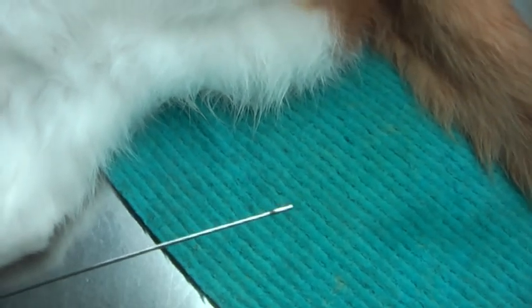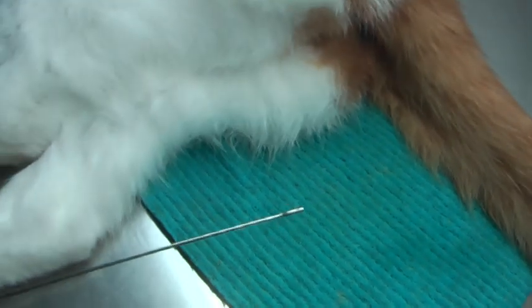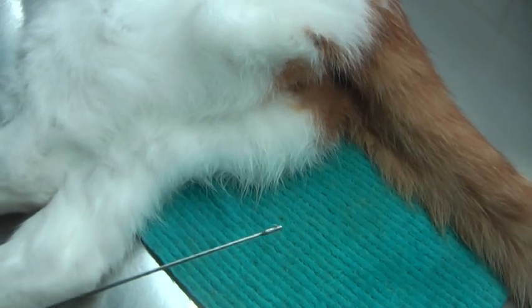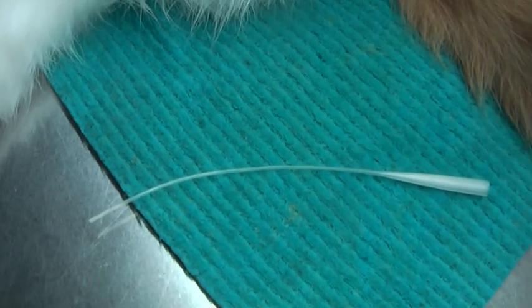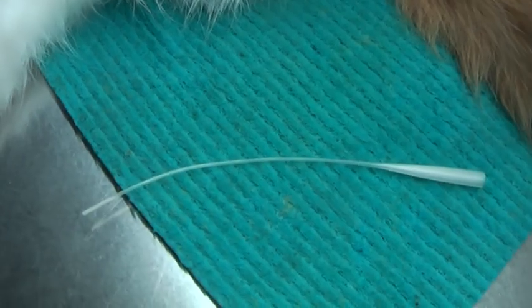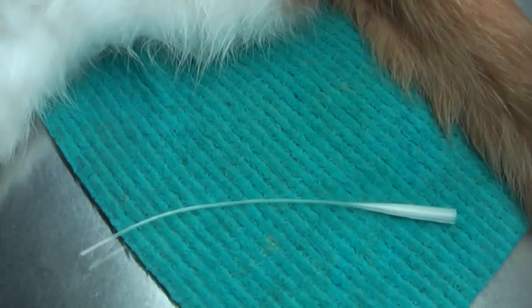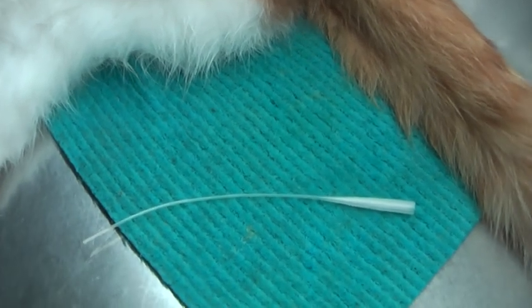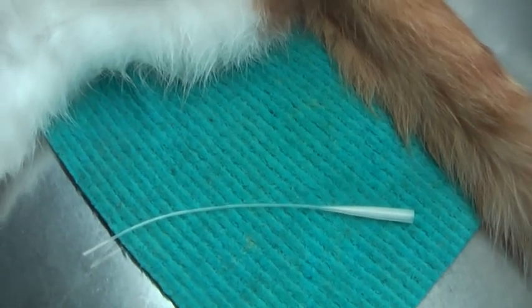Only a few seconds inside the penis. This will help to destroy, to demolish the small crystals — it takes only a few seconds, not longer. This other tool is not very helpful to destroy or crush the small crystals; it just pushes them further towards the bladder. We can use it later for rinsing the bladder, but not to destroy the crystals.